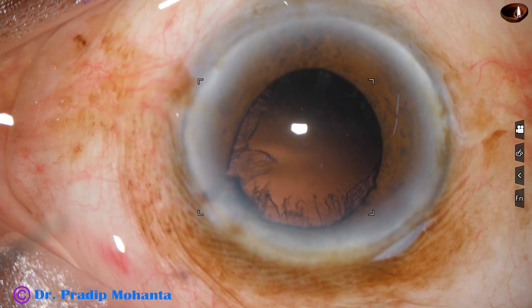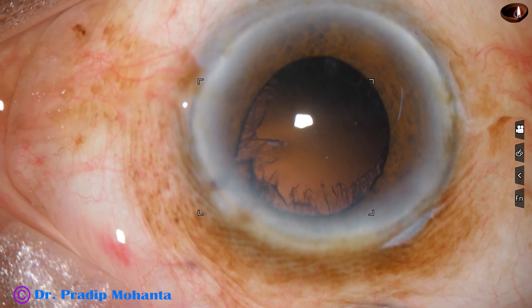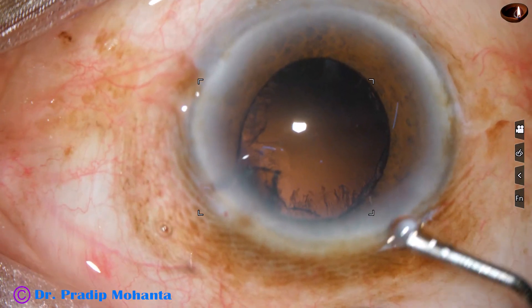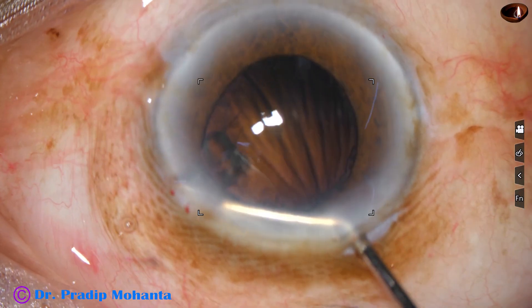Whenever the iris is in the side port, remove the handpiece first, let the iris fall back, and then remove the chopper.